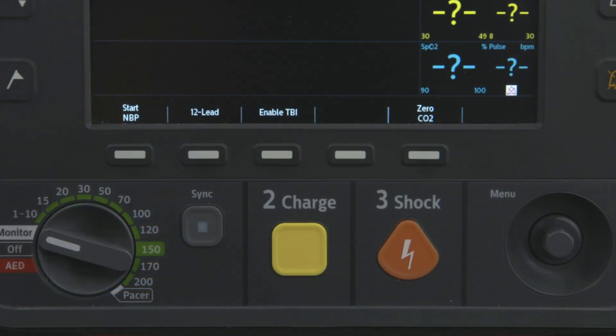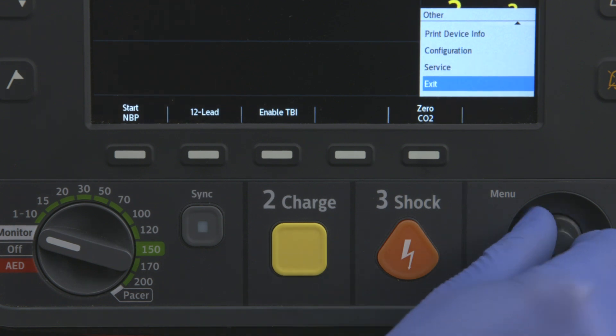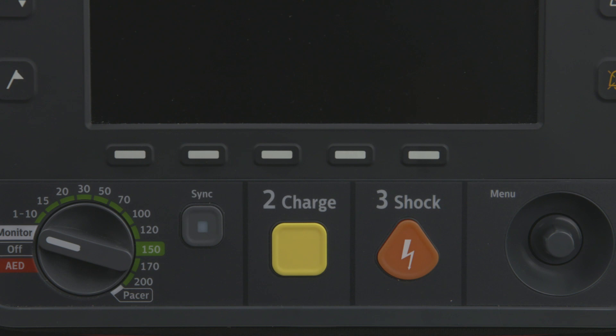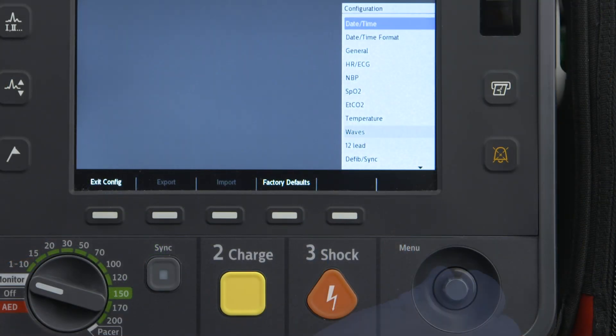To configure the HeartStart Intrepid for wireless communication, use the Smart Select knob to select Main Menu, then Other, then Configuration. Select Yes to exit Clinical Mode. Press the Smart Select knob and the Configuration menu opens.